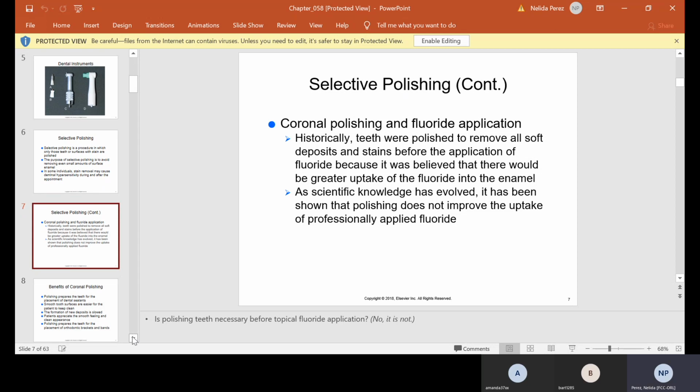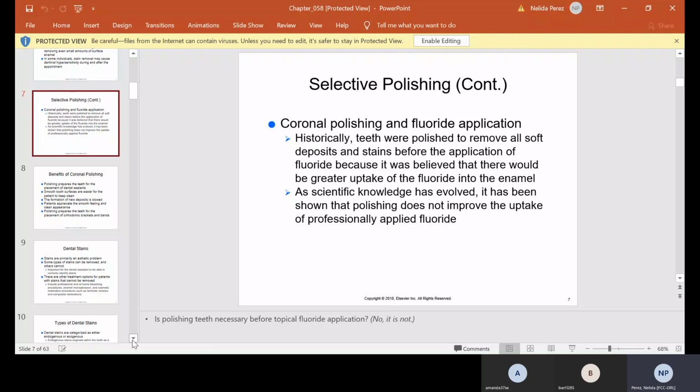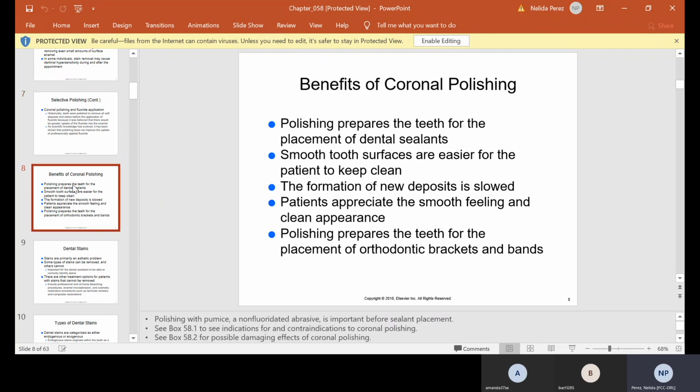Coronal polishing and fluoride application. So historically, teeth were polished to remove all soft deposits and stains before the application of fluoride because it was believed that there would be greater uptake of the fluoride into the enamel. As scientific knowledge has evolved, it has been shown that polishing does not improve the uptake of professionally applied fluoride. Now, the benefits of coronal polishing.